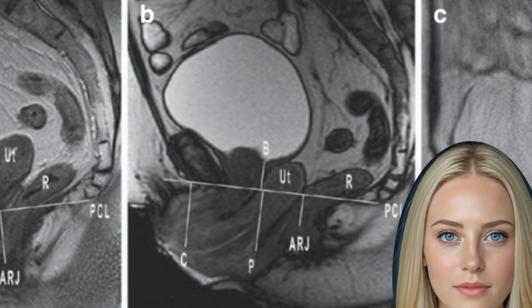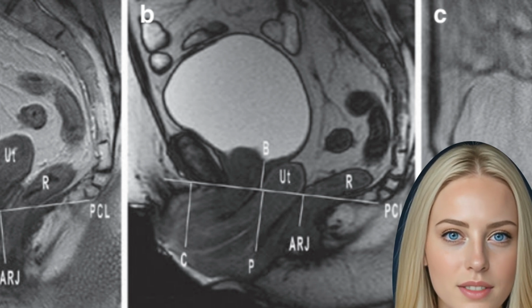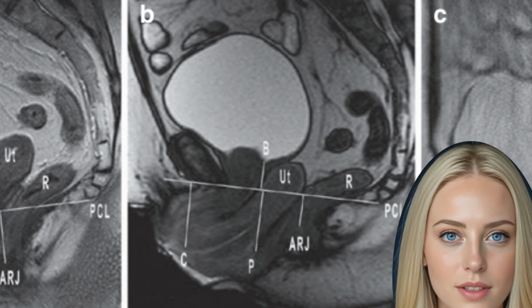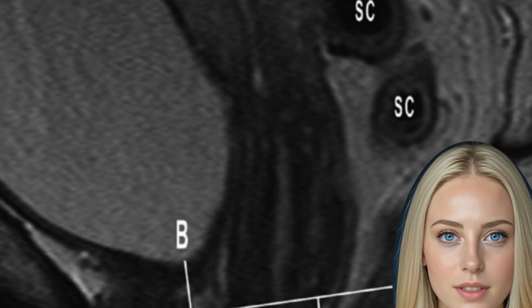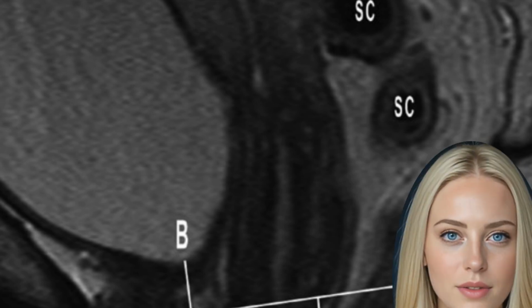To evaluate the pelvic floor structures and its integrity, MRI with high-resolution T2 weighted images are performed at rest. This is best done in 3 planes. The dynamic MR scans are performed during straining or defecation in the sagittal plane to evaluate pelvic organ prolapse, POP, and concordant PFD. The radiological report should give standardized measurements of pelvic organ prolapse, as well as a quantitative description of the pelvic organ position at rest and during straining or evacuation.